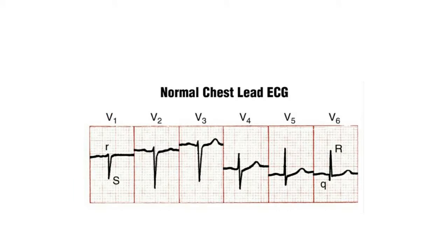So when you look at the chest leads, notice that in V1 there is no Q wave, nor is there one in V2, V3, V4, or V5 even. Not until they get to V6 do you see a very subtle Q wave, which is that first dip down in the QRS complex. For some people, you might start seeing one in V4 or V3. So again, just because they do have one in those chest leads is not a bad thing.